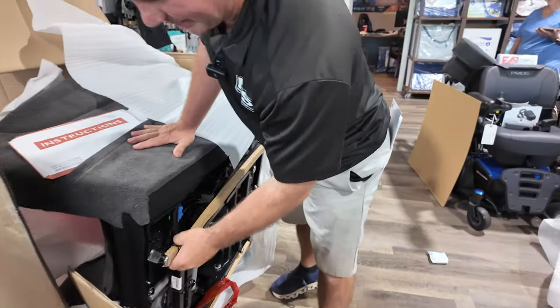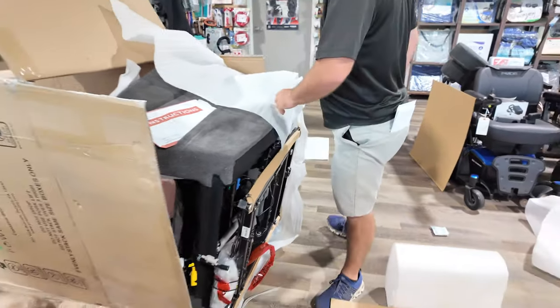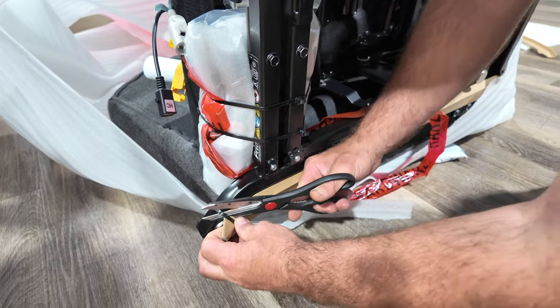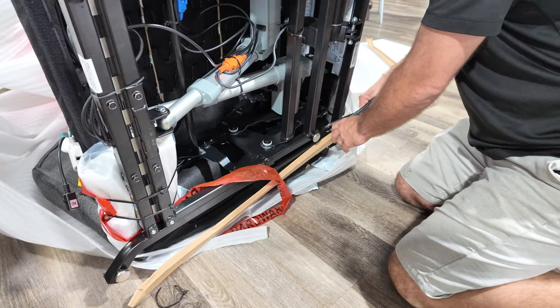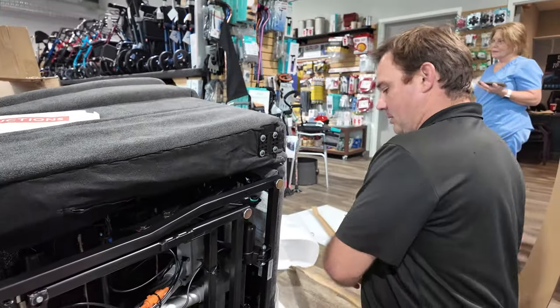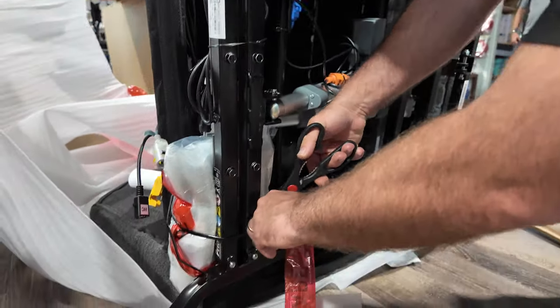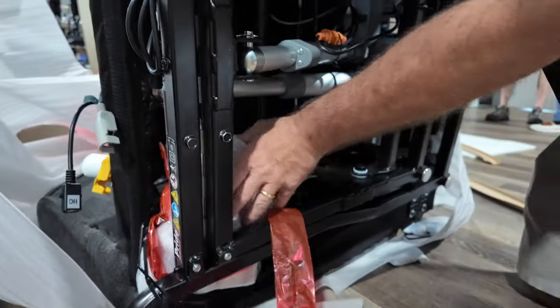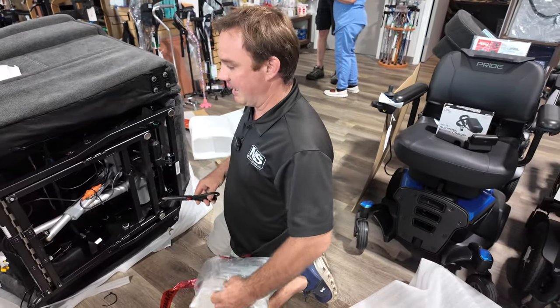Now you've got to remove this stuff — it's zip-tied on here. Don't lose your scissors; I'm going to cut all this stuff off. They package it well. This thing will ship to you pretty quickly if everything's in stock, and it seems like everything's in stock at the moment. I just shipped one of these chairs out to a lady out west — I've shipped three or four of these recently.